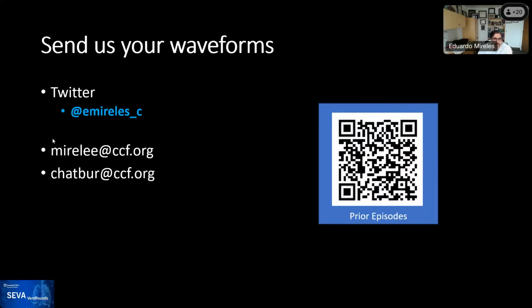Any final comments, Rob? I posted the link to PubMed for the paper that Ari and I wrote. Again, the apnea time interval for auto mode is unlike any other mode that we're aware of, and it can produce some unexpected results. So I recommend that anybody who wants to use auto mode be at least a little bit familiar with how the apnea time works.